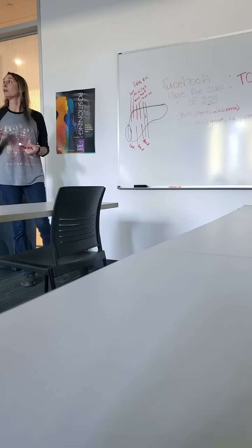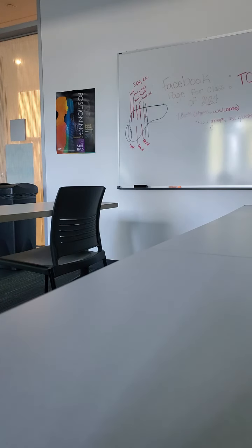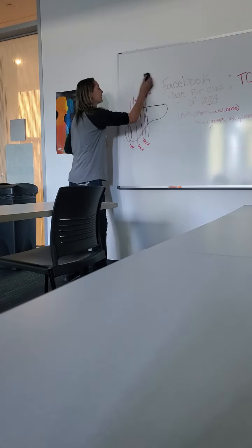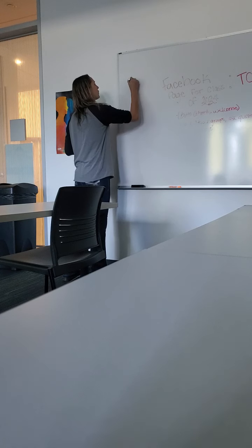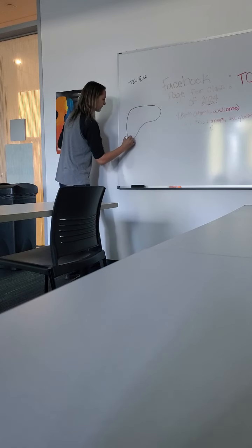Are we still following? Still tracking? Okay. Now, transverse, similarly to the left liver lobe, is going to be much easier to evaluate because it has all those landmarks. So not a lot of landmarks in sag, tons of landmarks in transverse. So we're going to take 4 images in transverse, and again, they're all annotated transverse right liver lobe. We've got a little kidney down here.